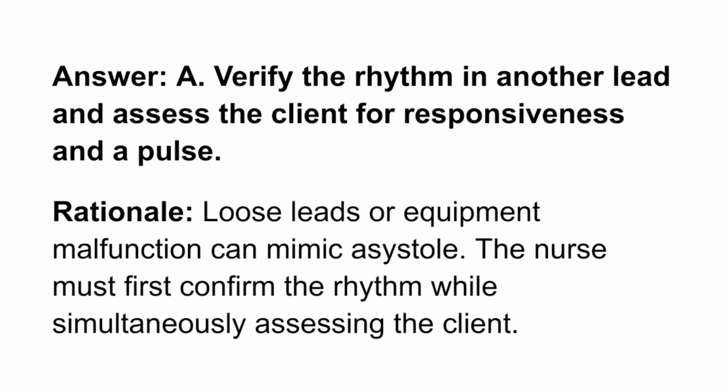Rationale: Loose leads or equipment malfunction can mimic asystole. The nurse must first confirm the rhythm while simultaneously assessing the client.